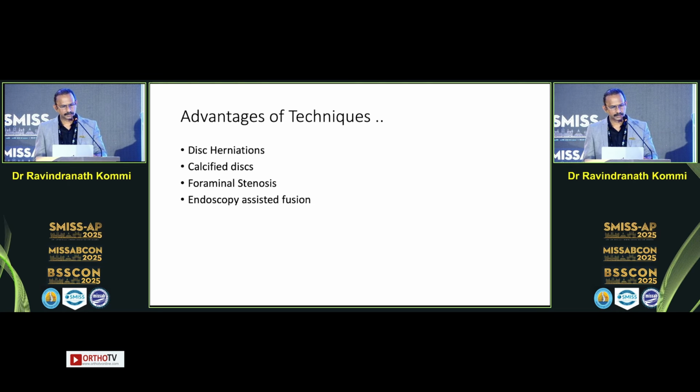Now I'm going to highlight the advantages of this technique on some case scenarios where we deal with different types of disc herniations, as some disc herniations are more difficult to deal with than most of the easier ones. Calcified discs, foraminal stenosis, and endoscopic assisted fusions.